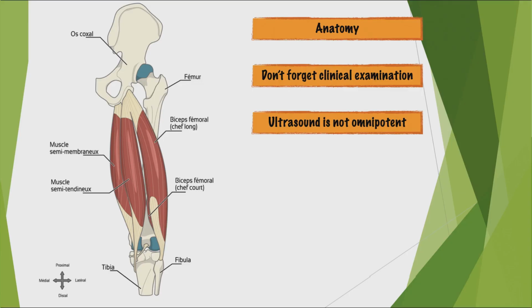Another example here that I didn't keep the images of, because it didn't help me. But sometimes the low-frequency probe will help you spot the structure you're interested in. And then you switch back to high frequency, positioning the probe in exactly the same place. And sometimes that can help you go straight to the right structure, because sometimes you need to have a wider field, a bigger view to be able to find your way around.